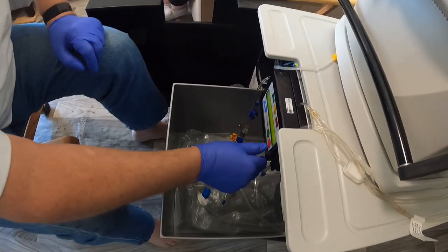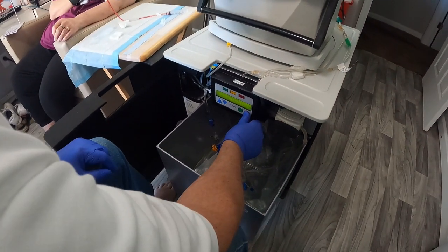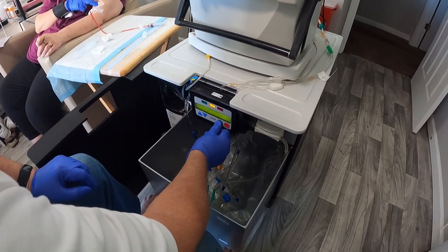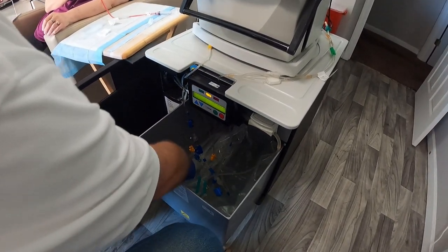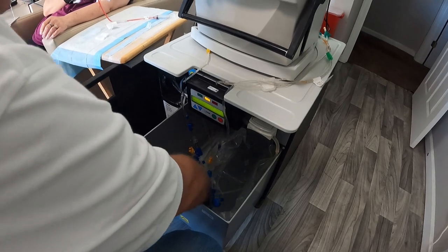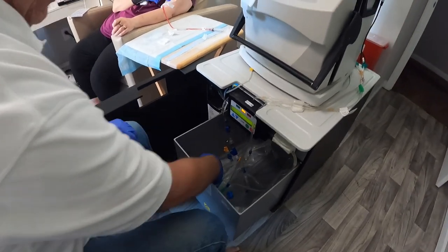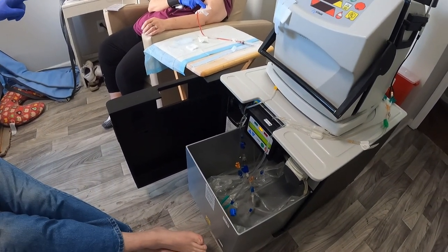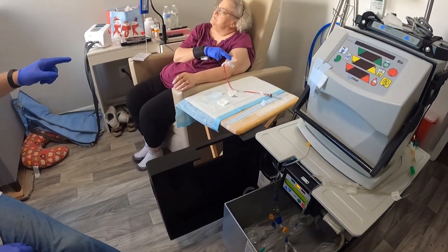So, first thing you do is hold this button down and drain or cancel. We say drain. And now it'll pump out whatever's left. It usually is pretty even. You can see there's not much left in there. But we'll let that run for about 6 minutes. About the time I have to put that Band-Aid on, this thing will finish draining.